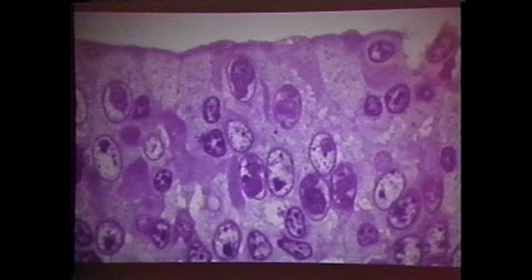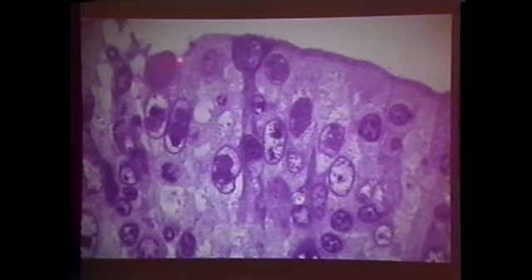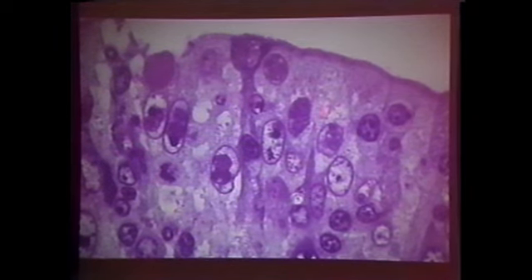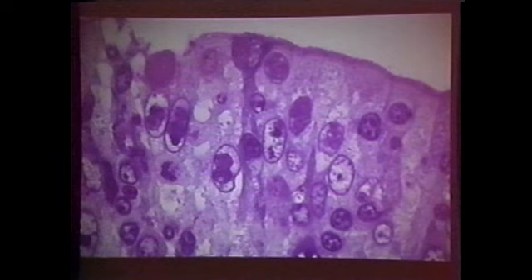Okay, what do you think those are? Since I'm talking, I don't think you'll call it bacteria. Anyway, here we go, and then we have this larger thing that has all these dots. Huh? Look at how many. Now that your eyes are attuned to it, you can see they seem to be multiply infected. These are 1 micrometer sections, by the way. This is not a normal 5 micrometer section. And then you can see some things that look like they have a shell and eosinophilic globular material. So what do you think it is?